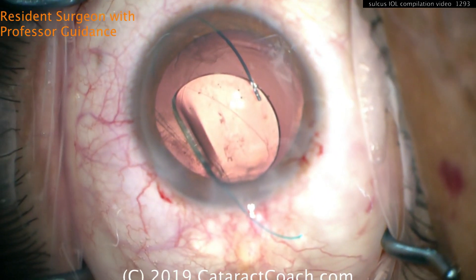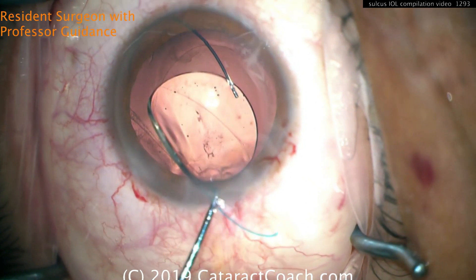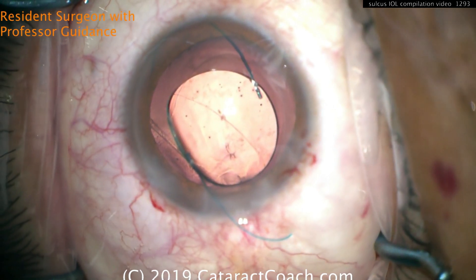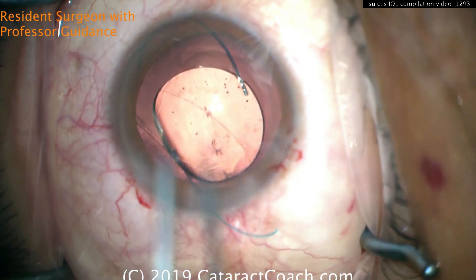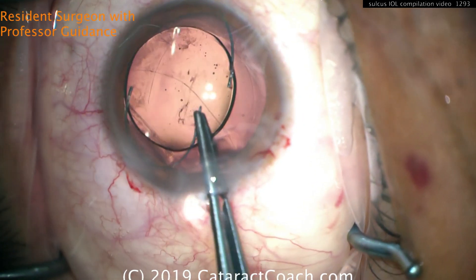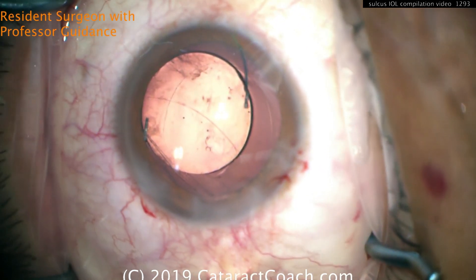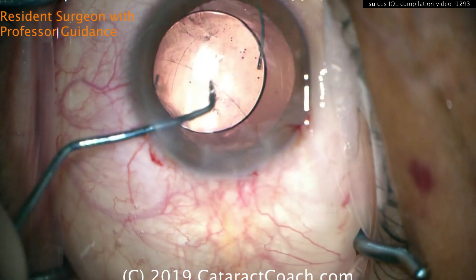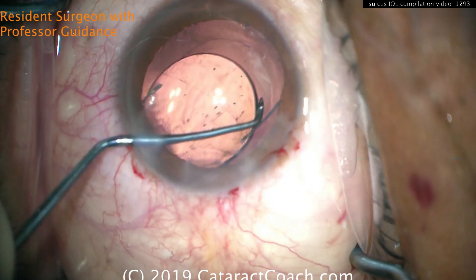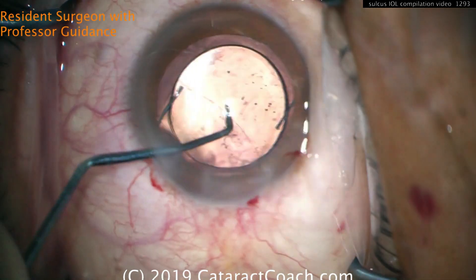Once the lens is on top of the iris, carefully dial it into position. The sulcus is the gap between the posterior surface of the iris and the anterior capsular rim. Remember, the lens is going to sit a little bit more anterior than its normal in-the-bag position. We should therefore adjust its power. You can also dial it into the bag and opt to capture it — we'll talk about that as well, as that changes power too.